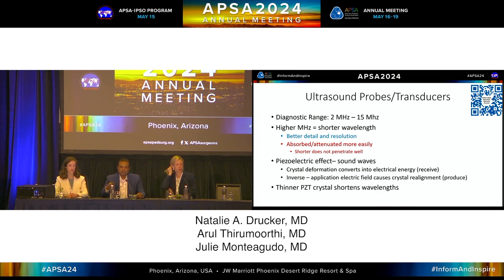Let's see here. I can get into the crystal effect. So we talk about what's going on for sound waves, right? The piezoelectric effect is really electrical energy being converted to mechanical or kinetic energy, and the crystal either sends out a sound wave, or when the sound wave comes back, it's reconverted to an electrical signal that gets interpreted. And the reason this matters is when you're looking at probes, if you want to get a different probe for your machines, thinner crystals, not just length, have different effects on wavelength. So a thinner crystal has a shorter wavelength, which is going to get you higher resolution.